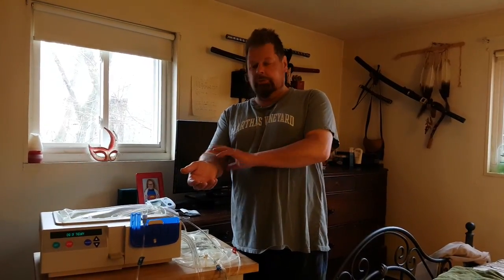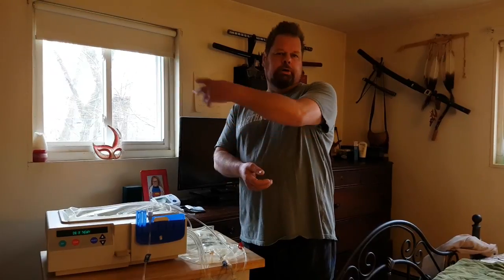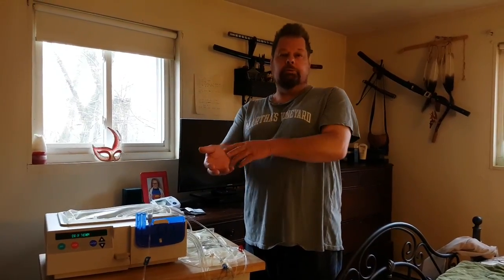So basically, I do it like 10 hours a night, every night. And this is a substitute for the more familiar dialysis for my kidneys. And it's a substitute for hemo. Hemo is the blood where it leaves your body, goes into the machine, gets cleaned, and then comes back into your body. Right. But you have to go to a clinic, and you're there for most of the day. It's a good 4 to 6 hours.